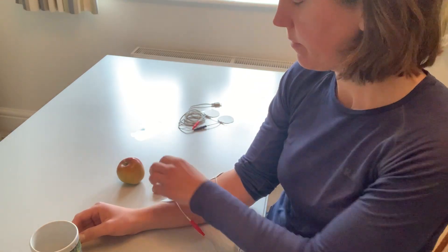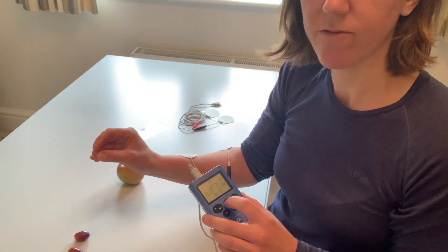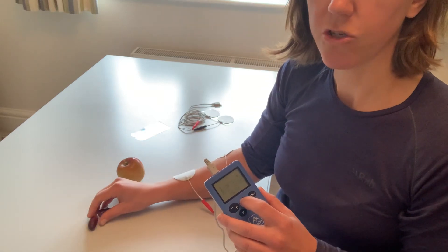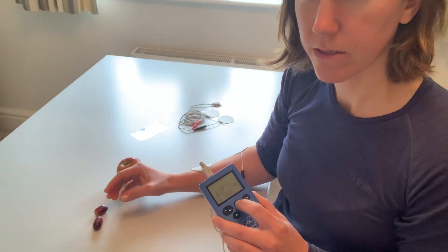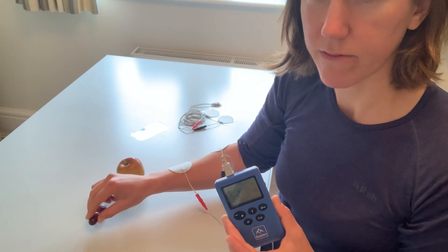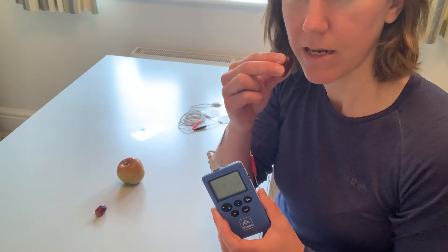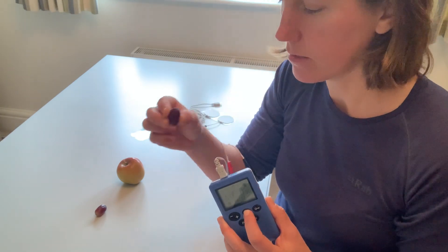Making it a little bit harder would be going down to something the size of these grapes, because I've got to have much more fine finger dexterity to get around them. Coming down and opening my hand up, I then have to really get my fingers around the grapes. I'm not stimulating while I've got hold of it. When I want to let go, I can just give that boost with the T button.